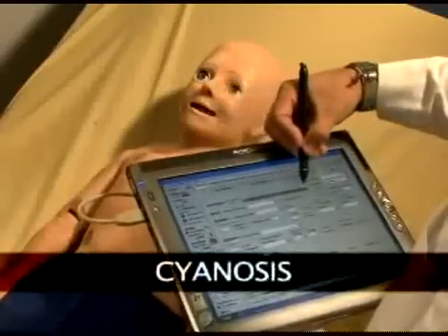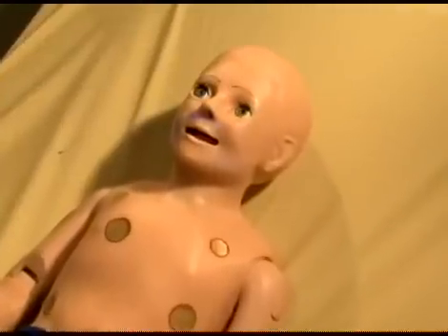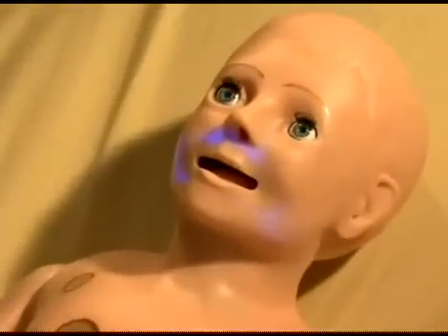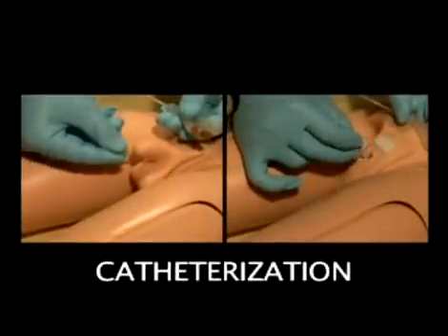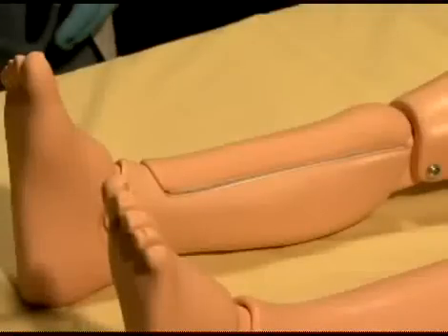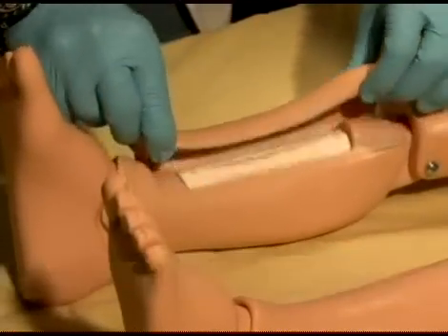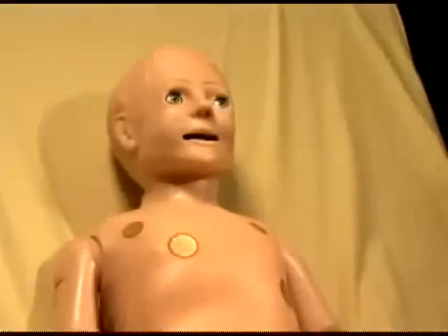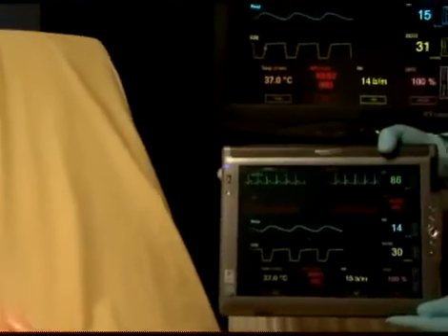The new cyanosis feature allows the user to control the pallor of pediatric HAL's skin when hypoxic events occur. Pediatric HAL can be catheterized via exchangeable male and female genitalia. The lower right leg has an intraosseous injection site with replaceable tibia bones. For additional realism, virtual vital sign monitors are available in both fixed and mobile formats.